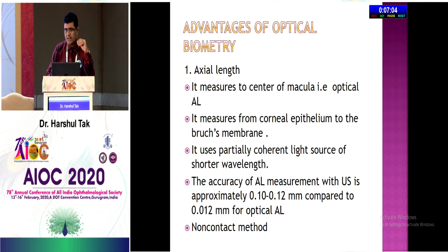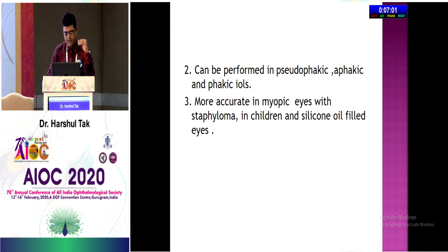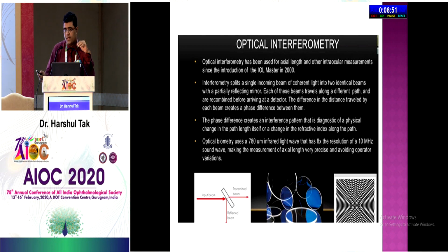And of course, another advantage is that it's a non-contact method, so it doesn't interfere with the keratometry also, because if you put the paracaine, the keratometry also changes. And then moreover, in patients who have a silicone-filled eye, the optical biometry doesn't change in those patients, whereas ultrasound waves travel with a different speed in different media, so we need to do some adjustment in those cases. So it's also advantageous for the cases which have silicone fill.